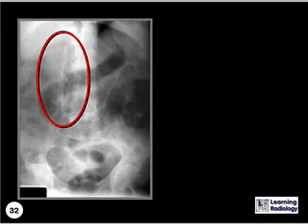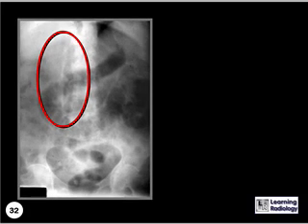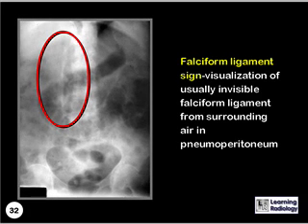What is the name of this sign? This is the falciform ligament sign, which is visualization of the usually invisible falciform ligament along the anterior edge of the liver from air surrounding it, as in pneumoperitoneum.